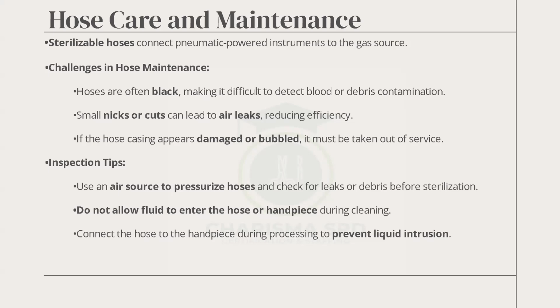Do not allow fluid to enter. I've said that already during cleaning because that can damage and can infect somebody. Connect the hose to the handpiece during processing to prevent fluid invasion. Yes, you can do that, so that you clean the handpiece and then you clean the hose as well.